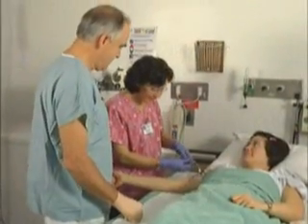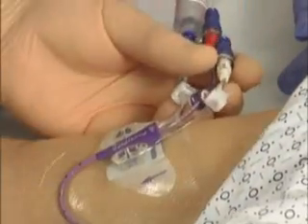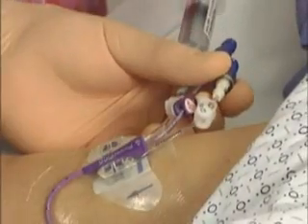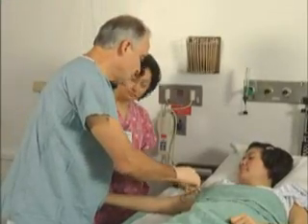Oh, hi, Steve. Steve, I cannot get a blood return from this. Okay, Joanne. Well, let's take a look here. This is a triple lumen power pick, and it has clamps, so we know it's an open-ended catheter. Do you know if this catheter has been flushed with heparin? No, it's the first time I've used it this shift. Well, let me try.